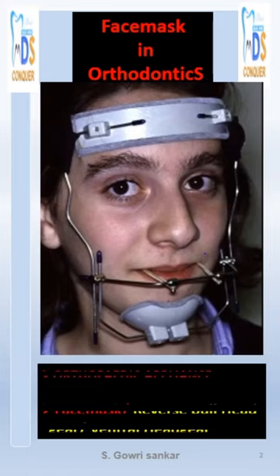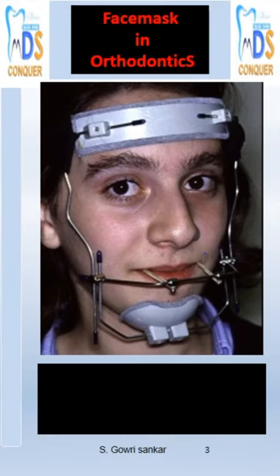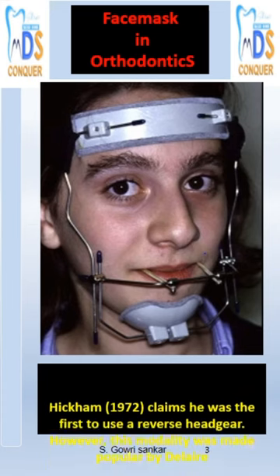Hi Conquerors, today we will discuss what is a face mask in orthodontics. A face mask is an orthopedic appliance, also called a reverse headgear or ventral headgear. It was developed by Hickamps and popularized by Delaire.